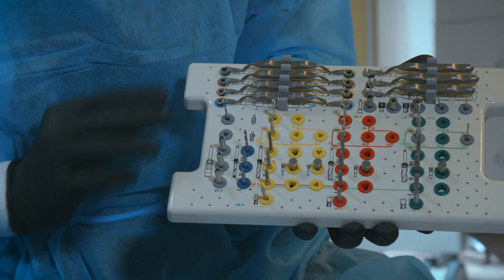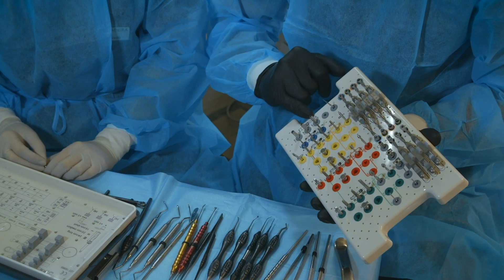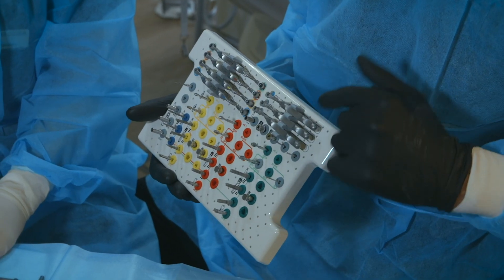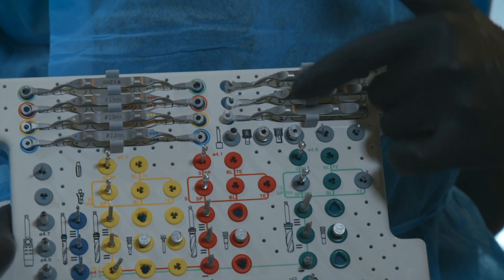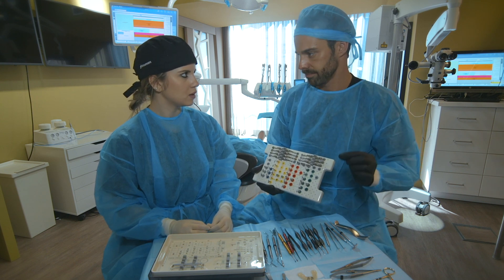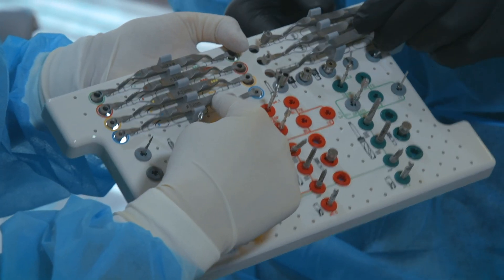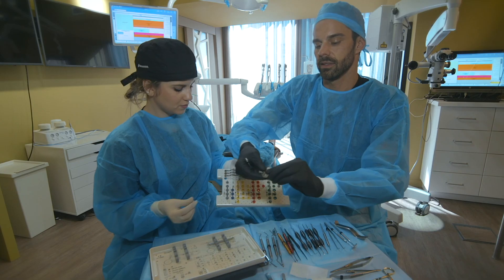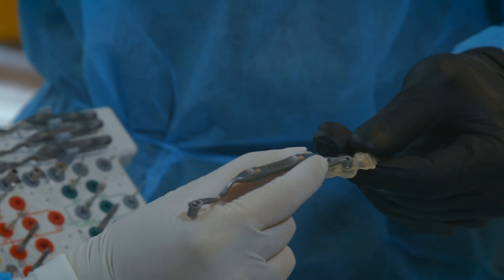Always keep in mind that the teeth and bone-supported guides are the most stable ones, but you should always adapt your choice based on the patient's situation. This is the new Straumann kit for the bone-level implants that we use. We'll start here — in this area we have the punch mucosa. After you remove the mucosa, we start with this driver. These drivers have three different heights: height 2, height 4, and height 6. This depends on the distance of the sleeve to the alveolar crest — if you have, in the lab document, one circle, two circles, or three circles, and then one line, two lines, or three lines, because it depends on the drill you use. When you use this driver, you will always have three millimeters on this side, not one millimeter.